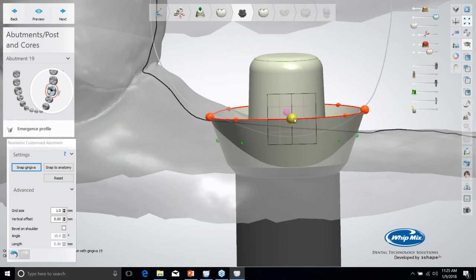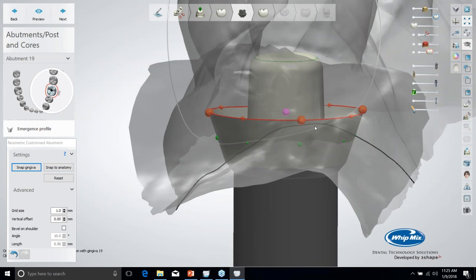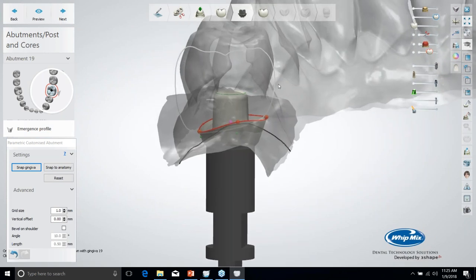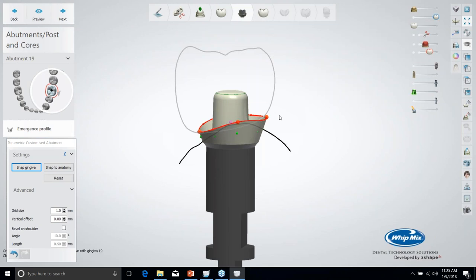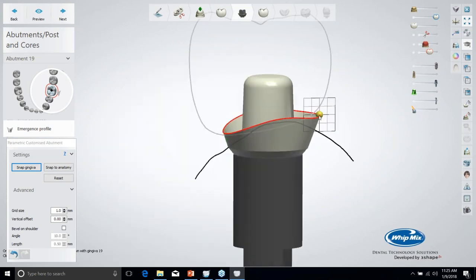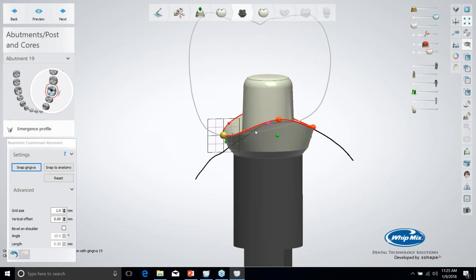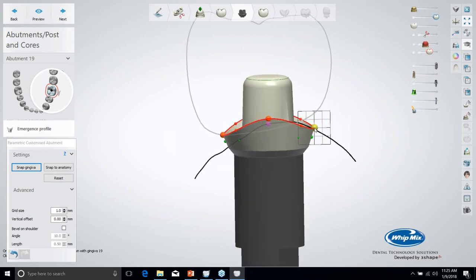Each time you click on one of these, you get a different black line, which is the profile of the tissue, following a 2D plane through that point. And you'll also get a 2D profile you can see of the tooth. That's the gray. And if you want, you can totally hide your working arch scan while you do this. And so what we're going to do is just match the profile to follow our tissue, or in this case, since I'm going to be filling some of this space with the tissue contour, I can just bring it up to meet my crown.